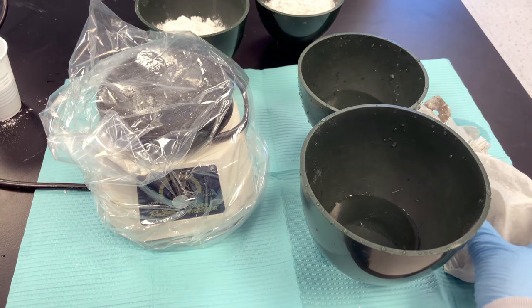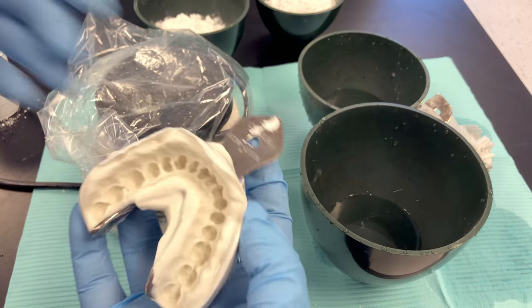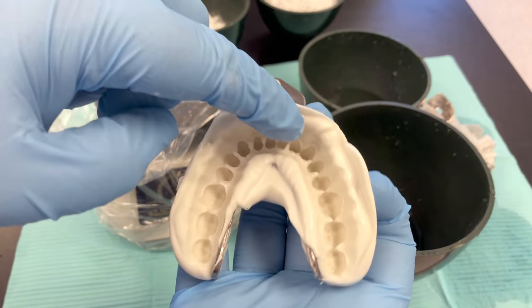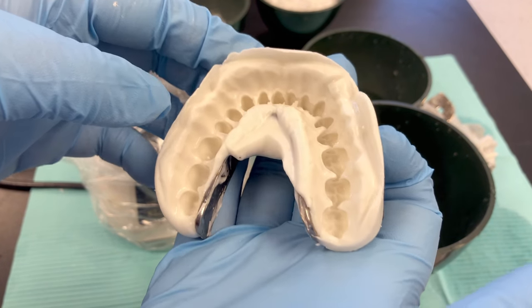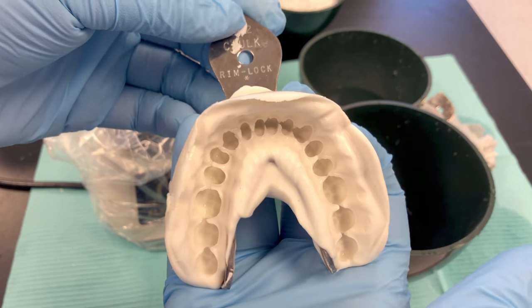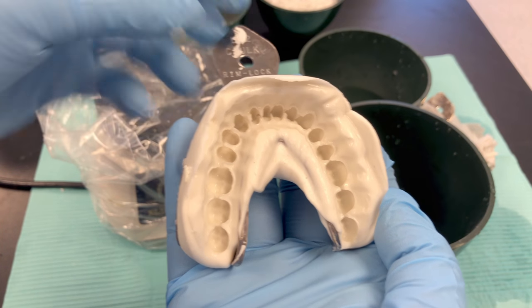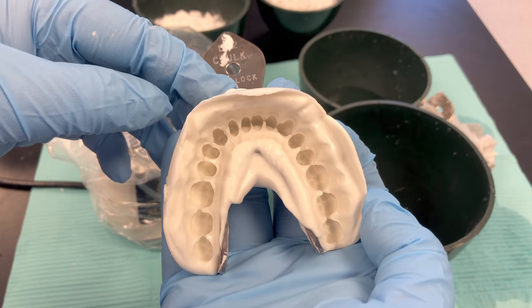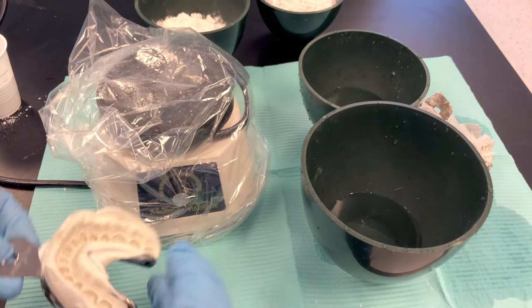Before I start my mix, I want to look at my impression. It's been disinfected and wrapped in a moist paper towel. I don't want to see standing water droplets in my impression — it should appear shiny, but no standing water. If there is water, blow it out with your air water syringe or if you have an air spigot in your lab, use that to blow out excess moisture. This looks good; I'm ready to mix.